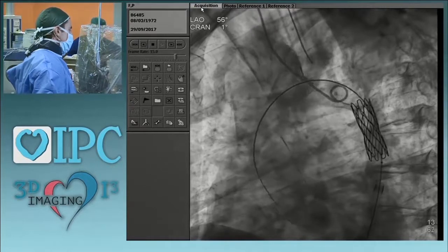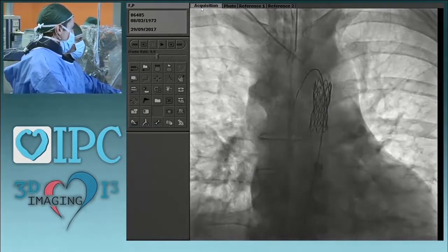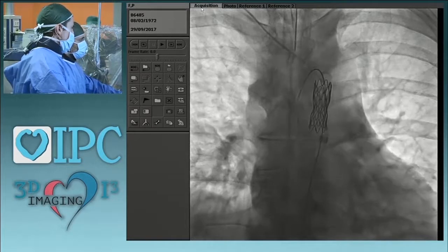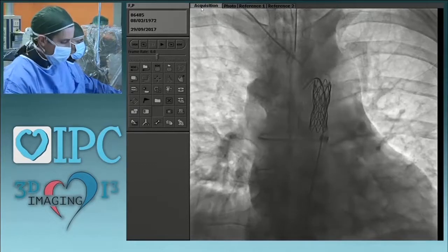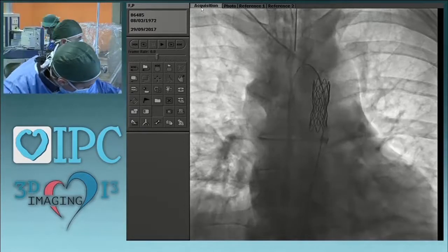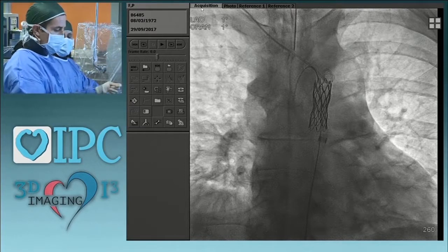There is no need in my mind. Do you agree? Yeah, we don't really post-dilate any of the ends. We don't try to flare or anything else. I think it looks great. Ultimately, his aorta below will probably get bigger, and someday, when he's an adult, you'll probably dilate this again, maybe one more time after everything gets a little bigger. But I wouldn't do anything more now. Yeah, me too. I think that we are okay.